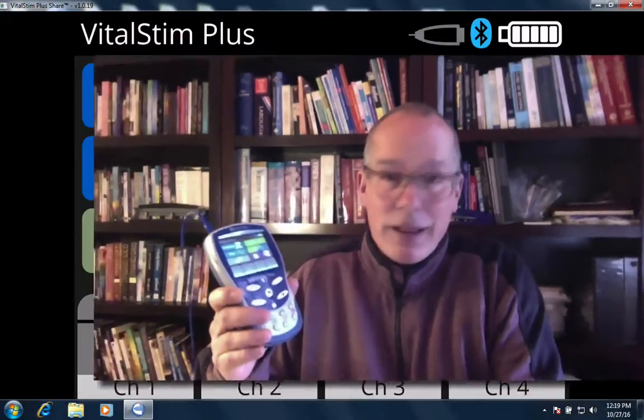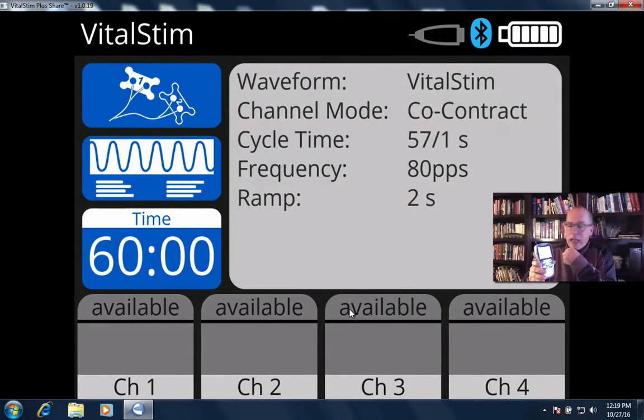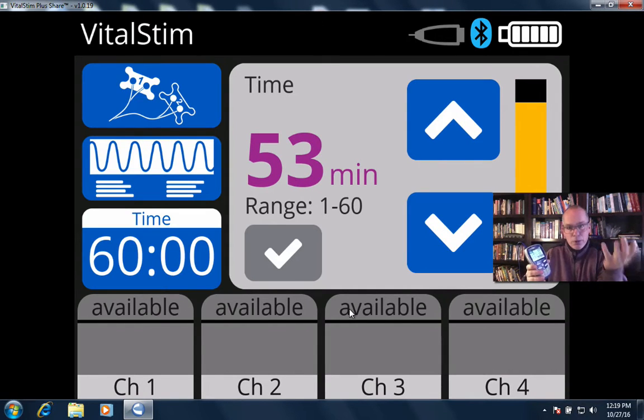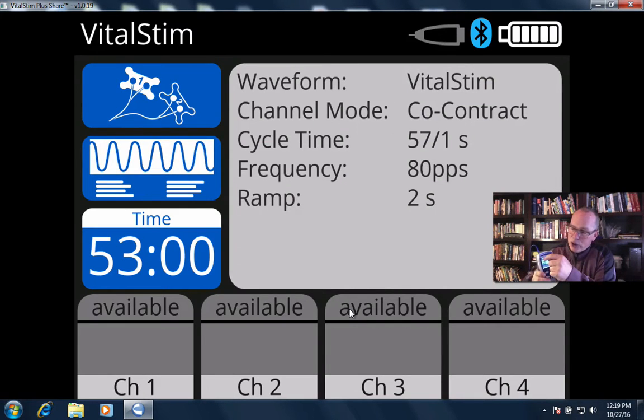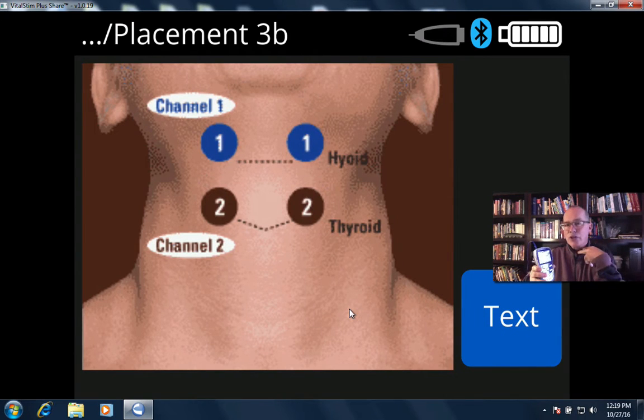This video I just want to quickly show you how to use VitalStim — there's really nothing to it. All you have to do is click on the VitalStim button and you see a couple of options. First of all, the time. I can change the amount of time that I'm going to be delivering the treatment for whatever I feel is appropriate for my patient, and then I accept that. I can go to the electrode button and get a couple of suggestions as to where to place the electrodes.